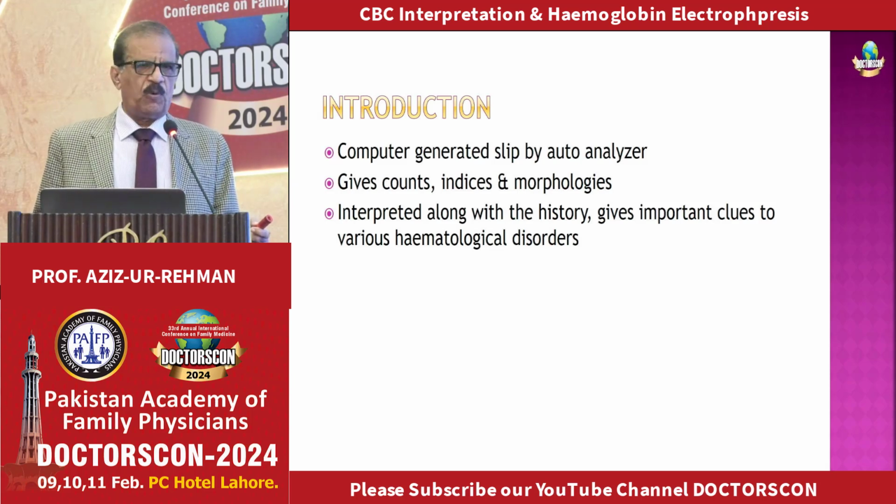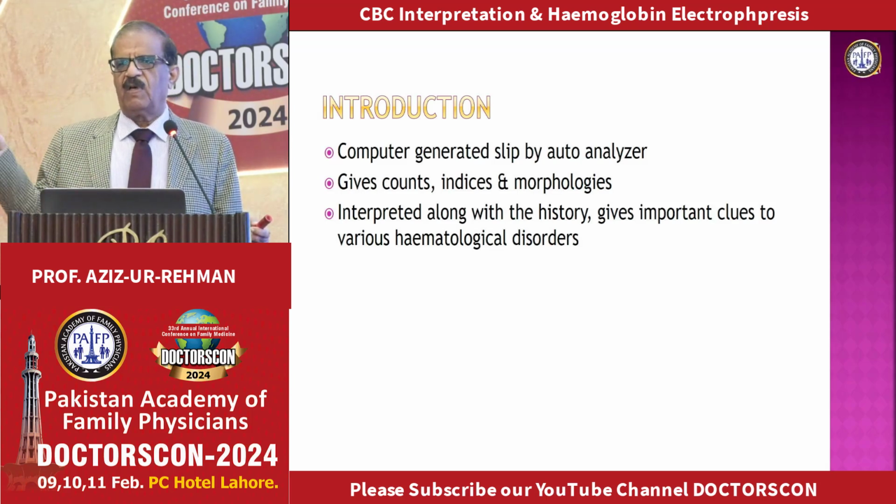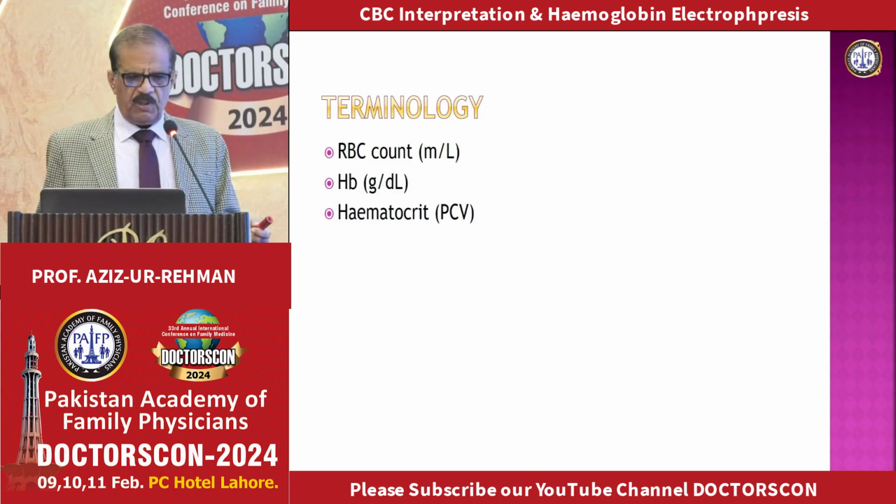History, of course, is important. So by the time you look at this CBC report, you should have something in your mind already. That patient is likely to have blood deficiency because of iron deficiency, something like that. So this is a terminology.